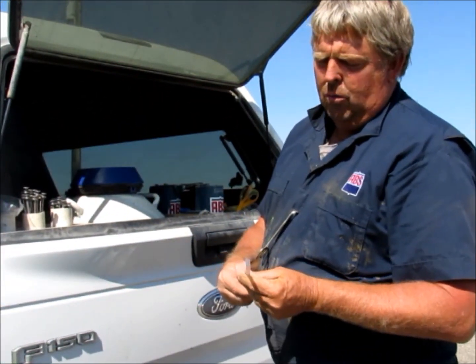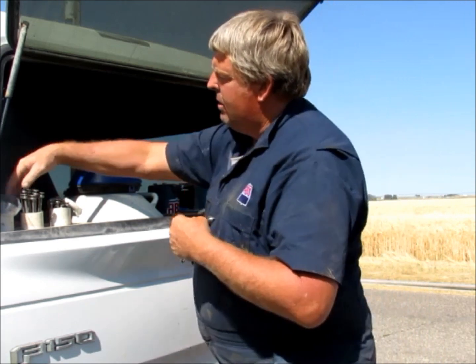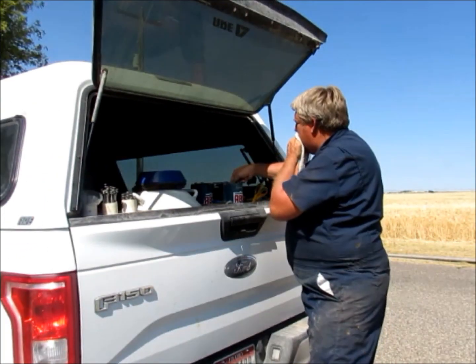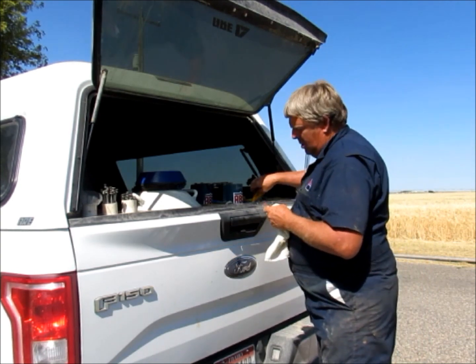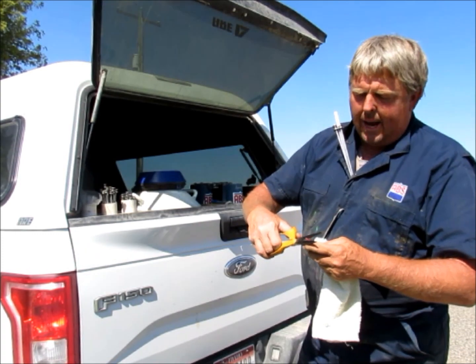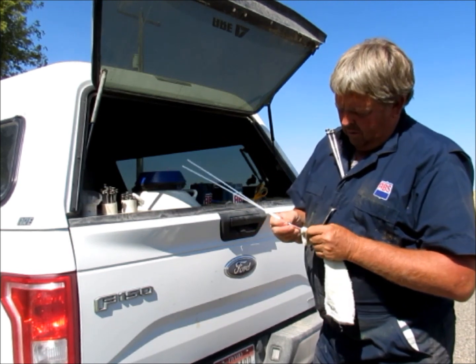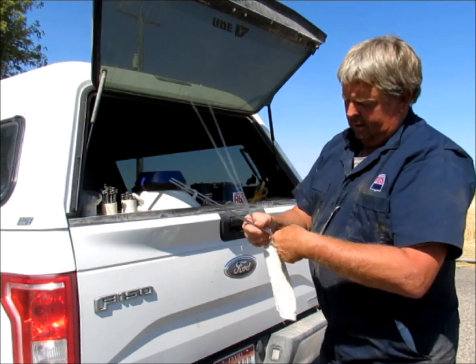We snap the units after cutting the crimped end off the straw. We snap them into a disposable sheath that goes over a stainless steel reusable gun. There are two ends to the straw: one end is crimped — that's the one I cut off — and the other end is a cotton plug which literally pushes the semen into the cow, almost like a syringe.